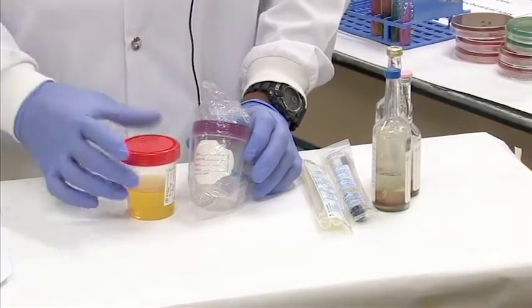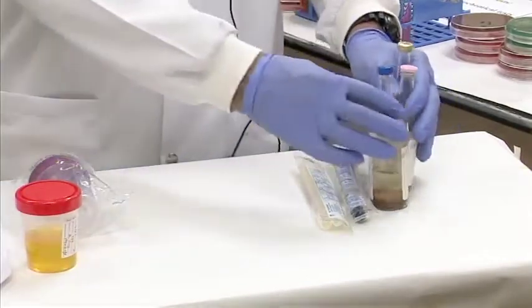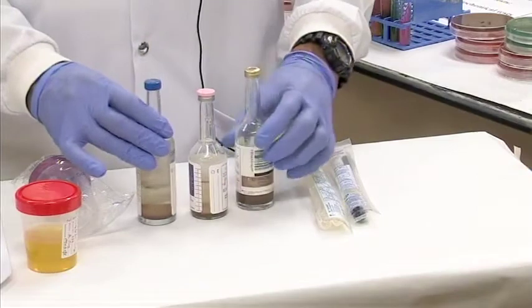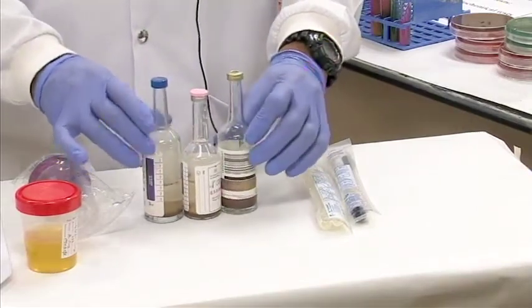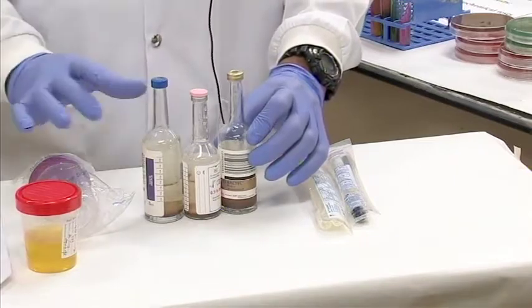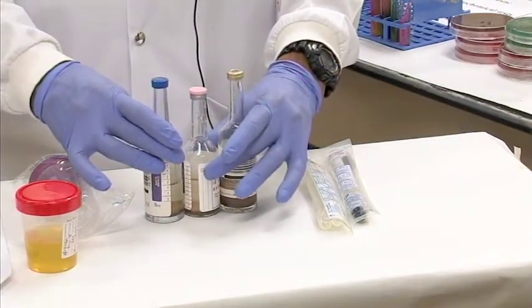Other samples you may encounter include the collection of blood for blood cultures. Blood cultures are very important, and they can be collected in different vials or pairs or sets of vials, which we will discuss in a later video.